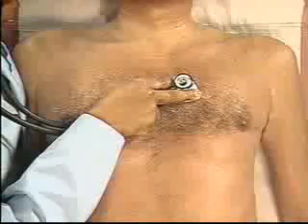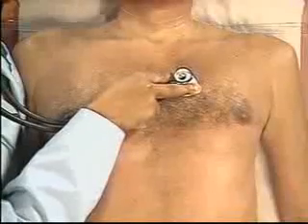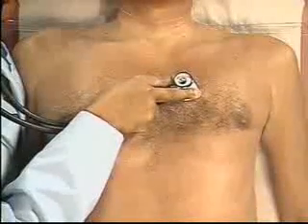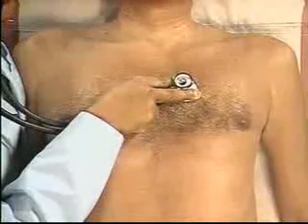Please breathe deeper than normal. Then listen at the left second interspace. Try to hear splitting of S2. Here it is abnormally wide. It comes and goes with respiration.